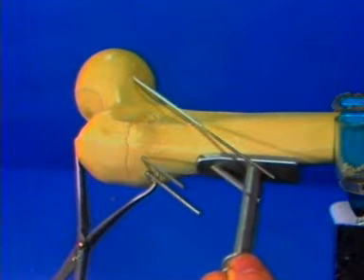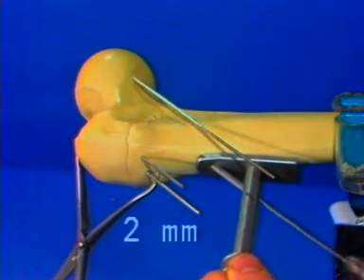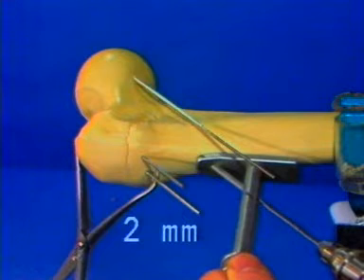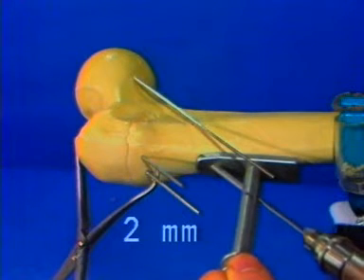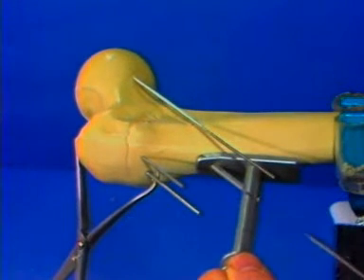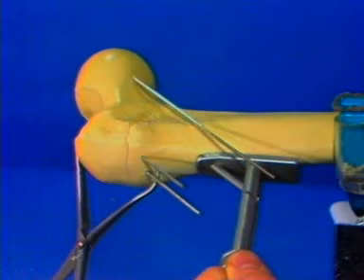The angle guide is now placed on the femoral shaft and a hole drilled in the cortex with the two millimeter drill bit. The direction of the drilling should be through the center of the femoral head and is parallel to the previously placed Kirchner wire.